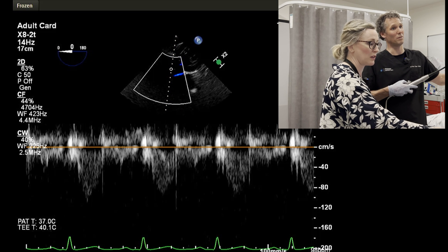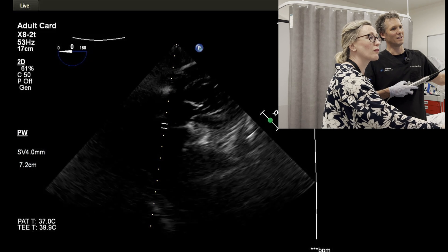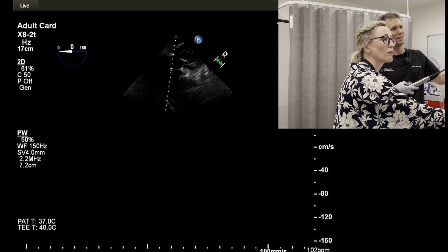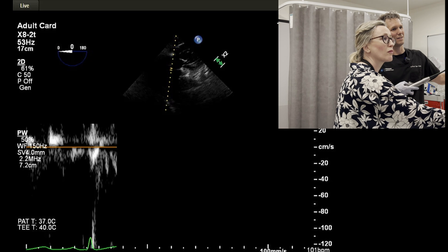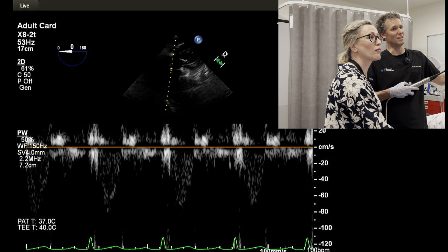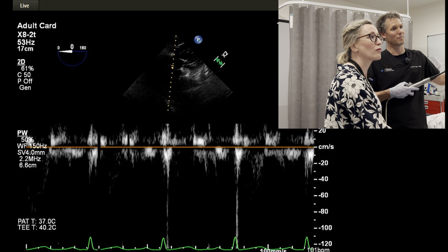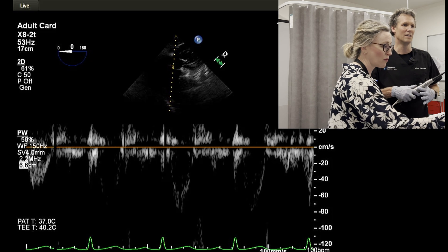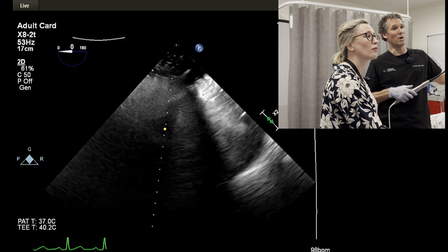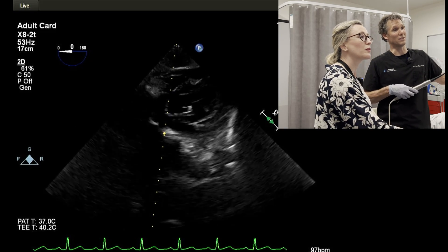If we then do pulse wave Doppler we can normally try and find — and that's maybe a way of starting to try and have a decent look at the deep gastric view.